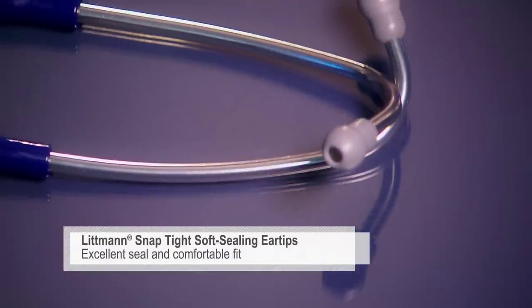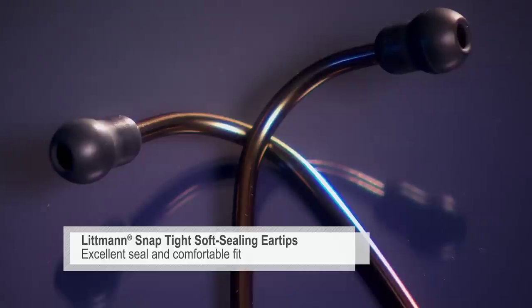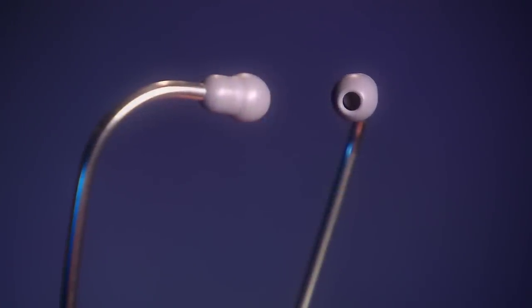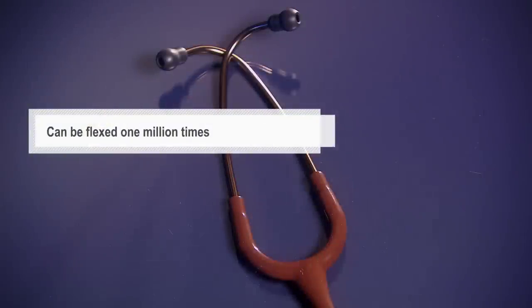Our soft seal ear tips with our patented SnapTight feature provide an excellent acoustic seal and comfortable fit. The anatomically designed headset, angled to fit the ear canal for maximum sound transmission, can be reliably flexed one million times.